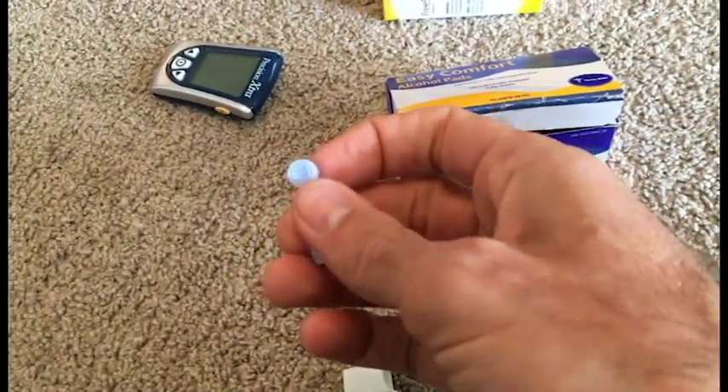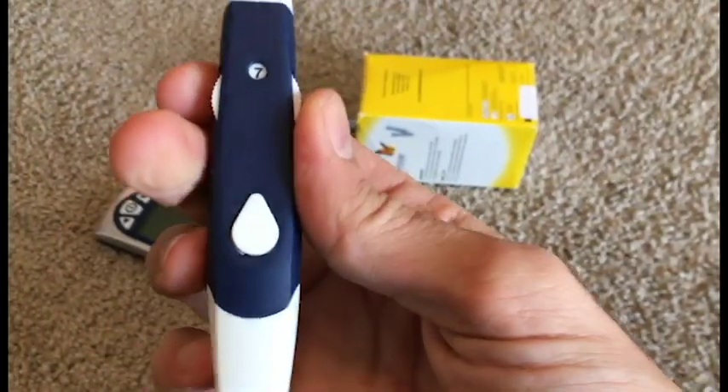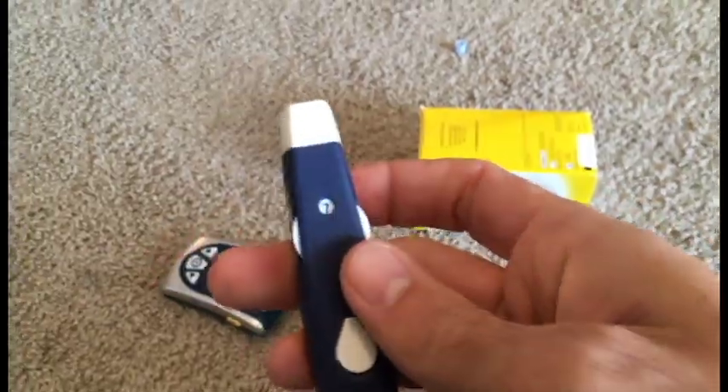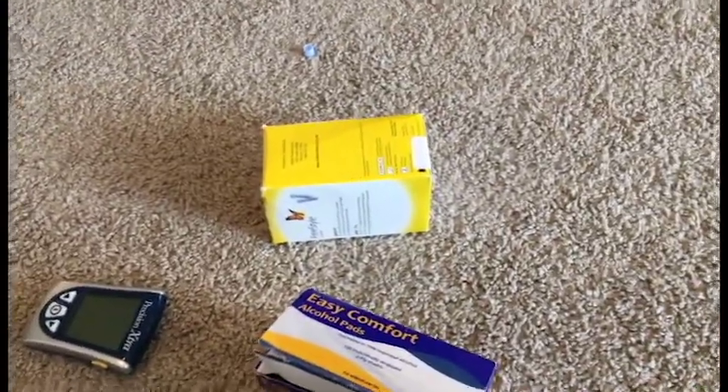I'm going to try to do this one-handed. So I need to take the circle cap off — okay, cap is off — and then the needle goes into this applicator like this, and then we put the lid back on it. This is set to a level of seven, so we want to make sure it goes into my finger deep enough to draw blood.